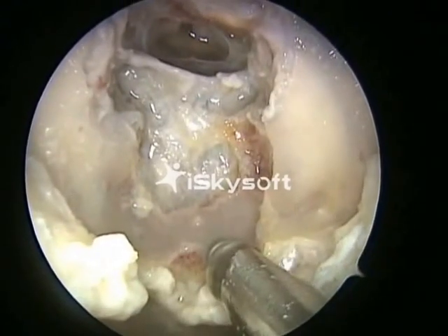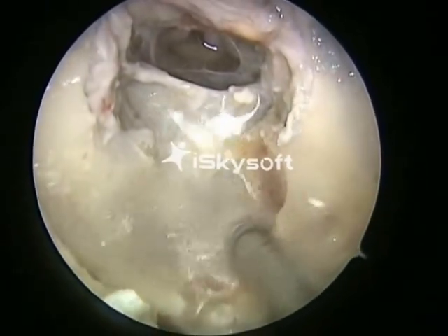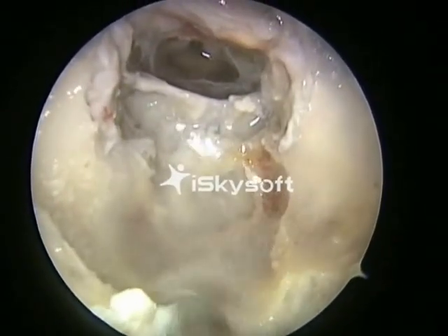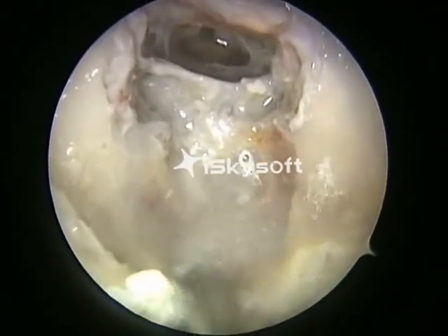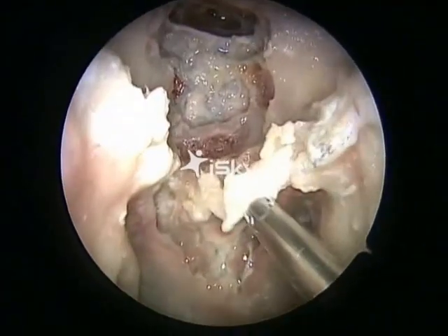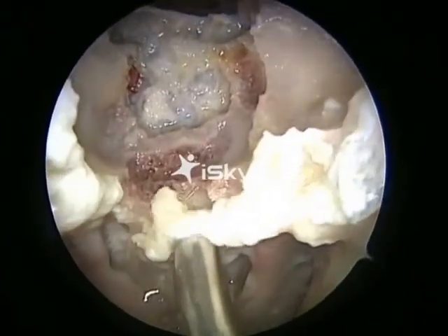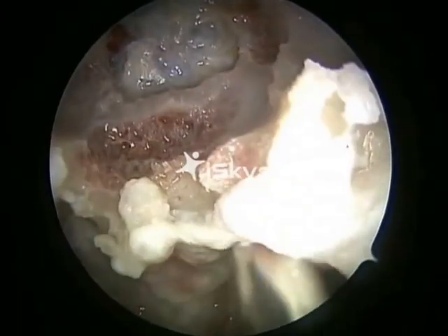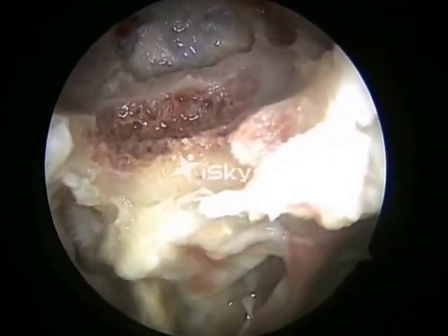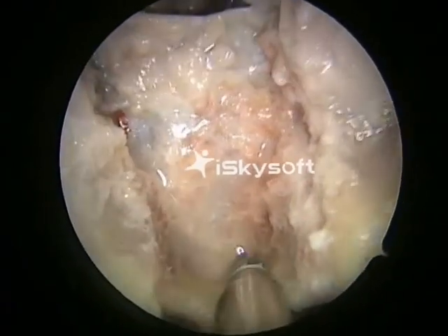A cutting burr is being used to take off the floor of the sphenoid sinus. In a live situation, if there is bleeding, we use gel foam paste. And now the soft tissue is being taken out using a debrider. The bone is being drilled out now.